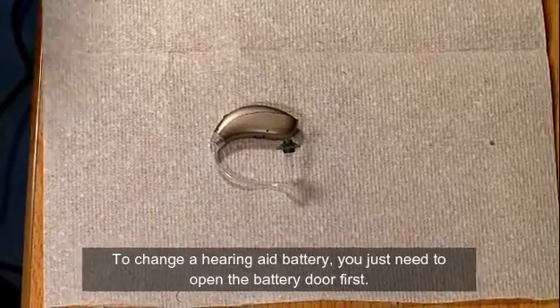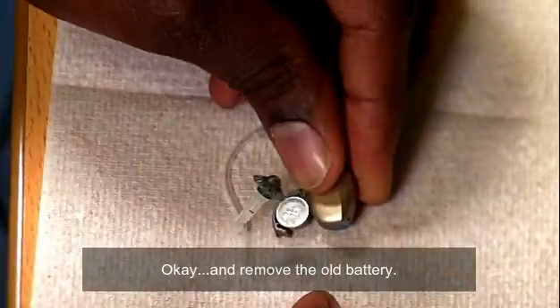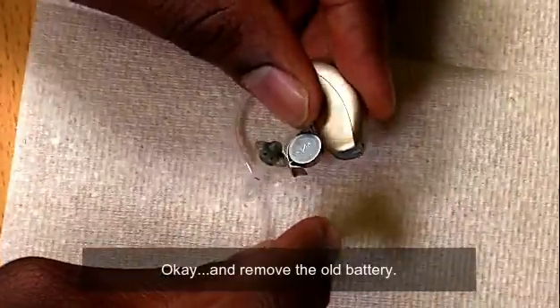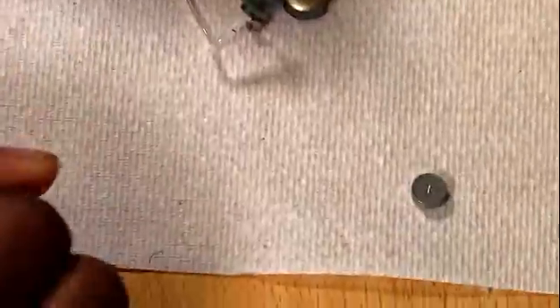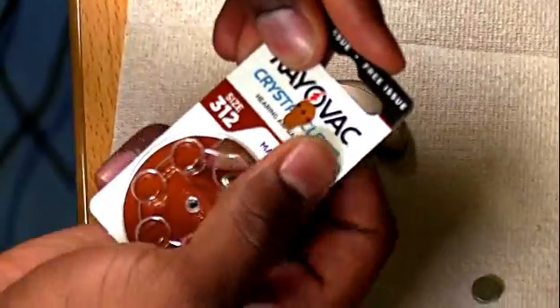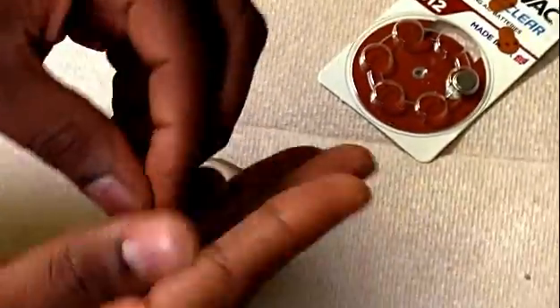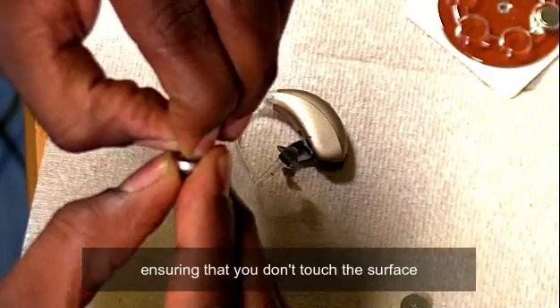To change your hearing aid battery, you just need to open the battery door first and remove the old battery. Get your new battery and take the sticky label off the battery, ensuring that you don't touch the surface where you remove the label.